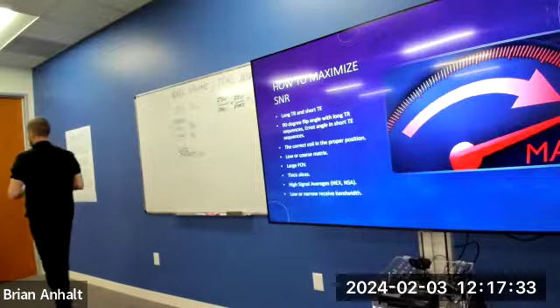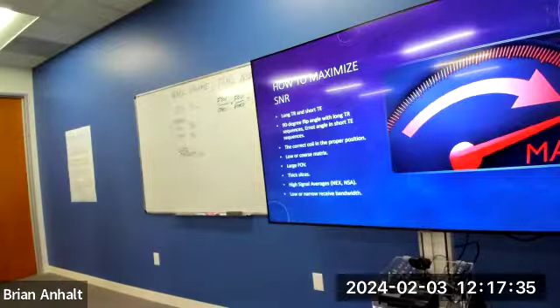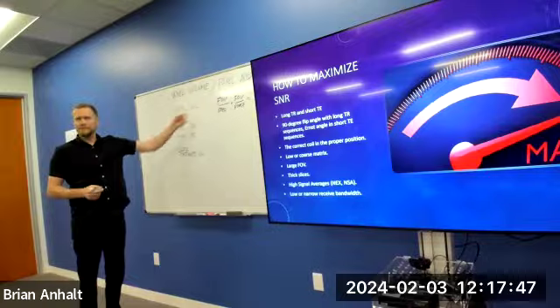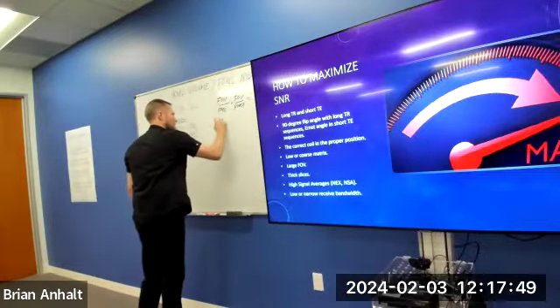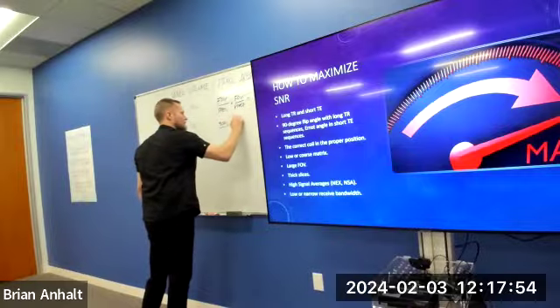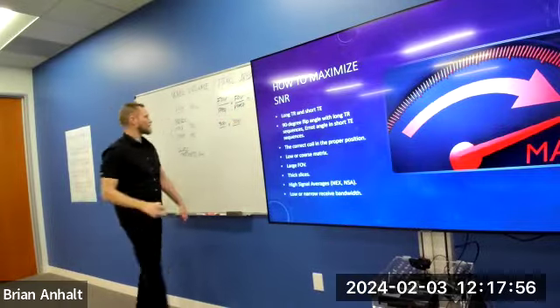We want to get it in millimeters. It's in centimeters right now, so how do we easily get it in millimeters? I'll give you a hint, there are 10 millimeters in a centimeter. So you just add a 0, right? Just multiply it by 10. So it'll be 300 divided by something times 300 divided by something else.